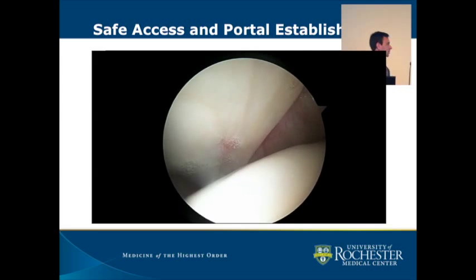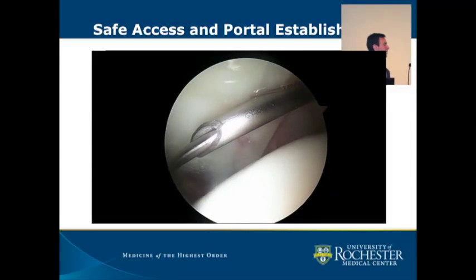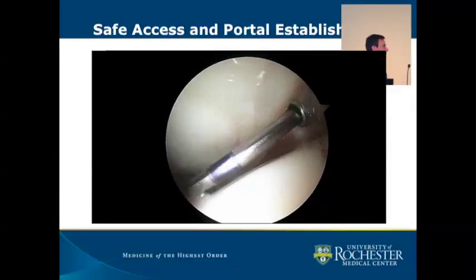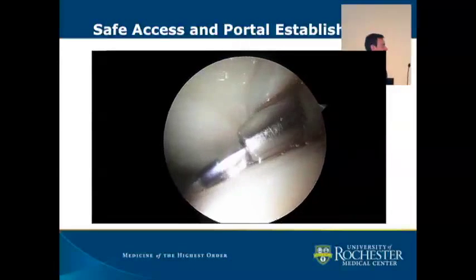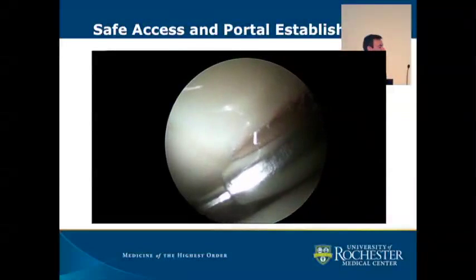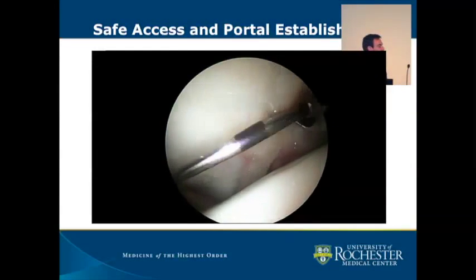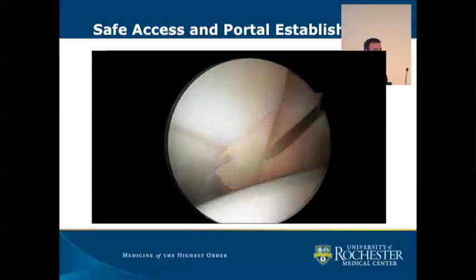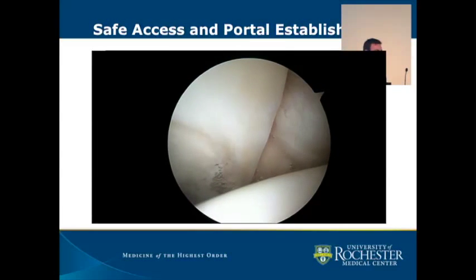So we're seeing, again, that anterior capsular triangle. I think the tendency early on is to really push the instruments deep into the central compartment, but you really don't need to be there as you're introducing these cannulas. You can really stay just within the capsule. I like to advance the beaver blade past the labrum as I pull the cannula up to make sure I'm not cutting the labrum inadvertently.